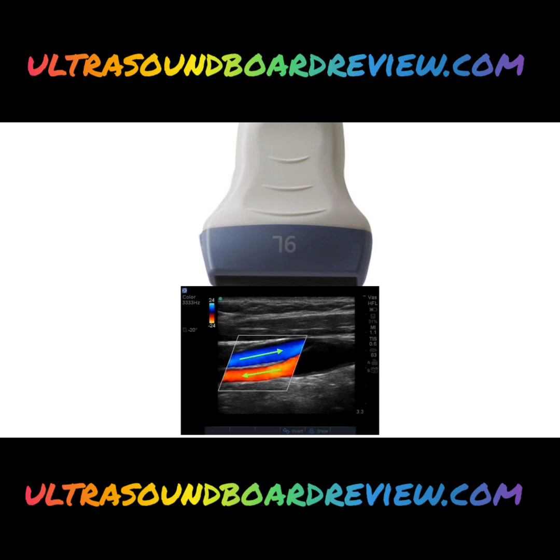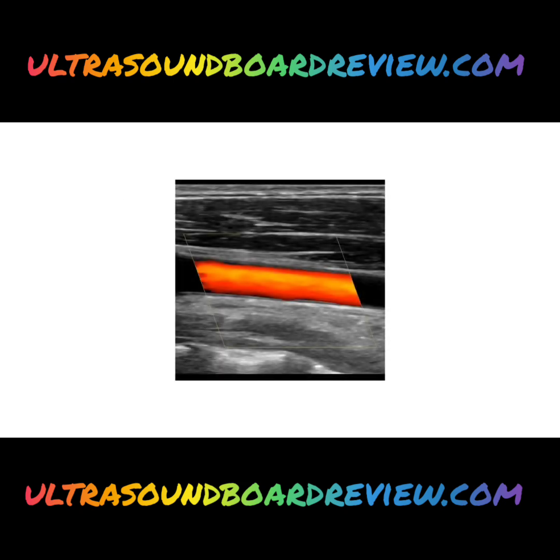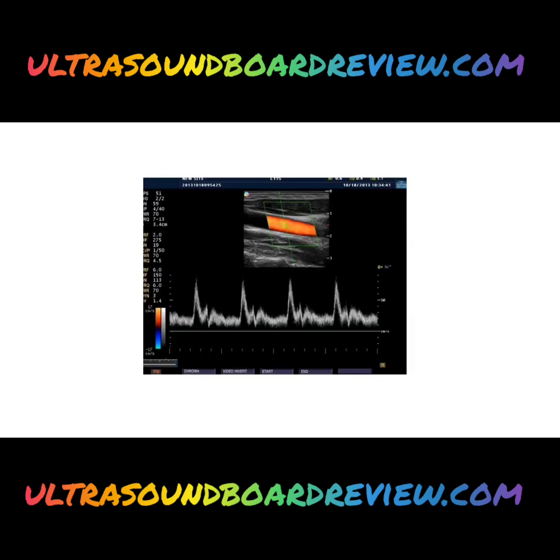The data in this image tells us where the flow is going. So how do we do that? Well, that's why you're here, and I'm going to tell you how. So first we need to start with a vessel, and we need some color, and most importantly, our color map. The color bar or color map is less like a map and more like a map key. So in this case, this map's key is telling us that the star means it's the state capital. It's really similar with ultrasound. Here is our key. We can use this bar in a similar way, and no, not to identify state capitals, but to decipher which vessel's flow is going where.